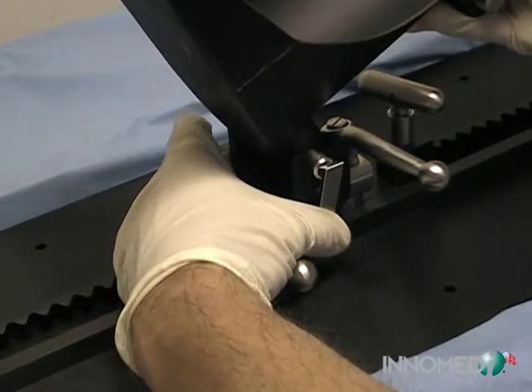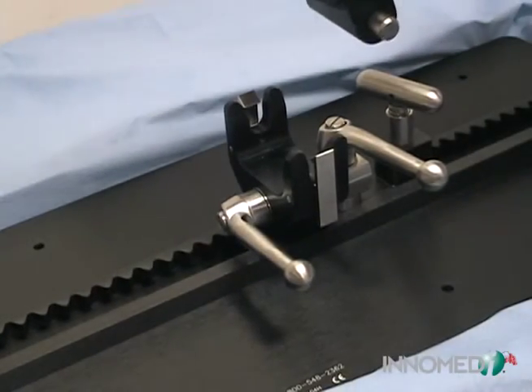Pressing the bottom portion of the clips on the sides of the yoke allows for easy release of the foot support.